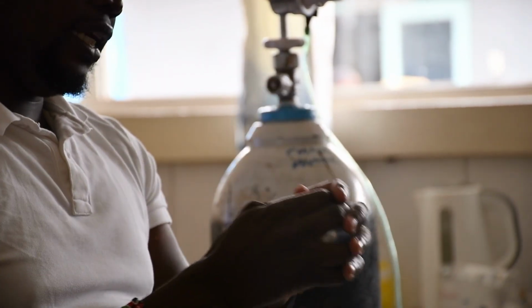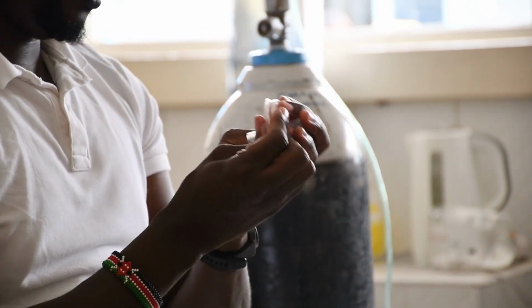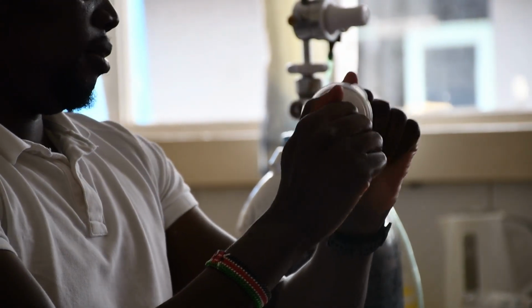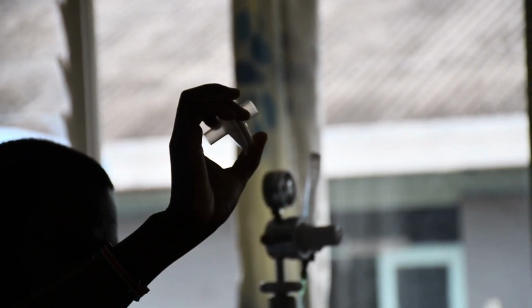You feel the point here, yeah? But just make sure that you press them hard, okay? After you press them hard, try to move it, it sticks, okay? So that's how the filter disc is assembled, okay? So the filter disc comes through.